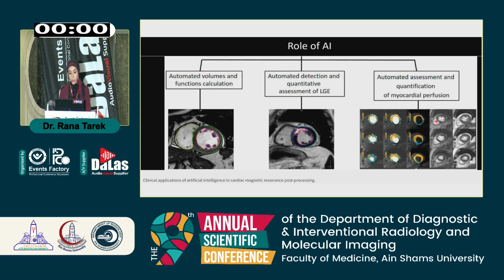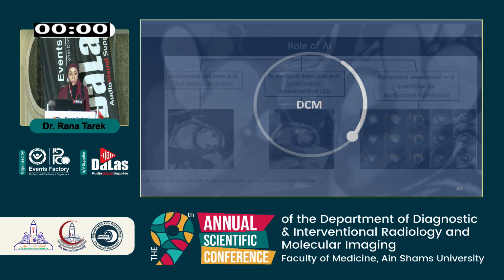And of course, we shouldn't forget the AI, which can help us get automated volumes and functions, automated detection and quantification of the scar, and quantification of the myocardial perfusion. Also with the strain, it can help a lot.